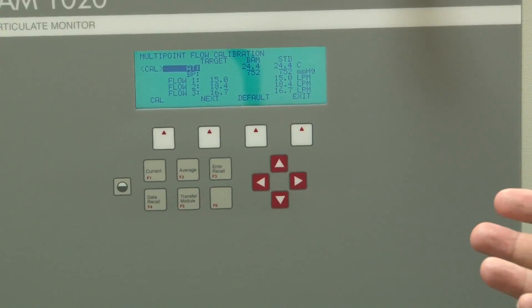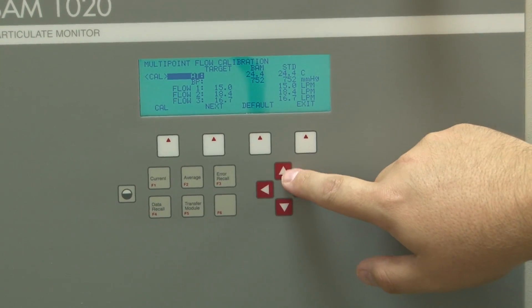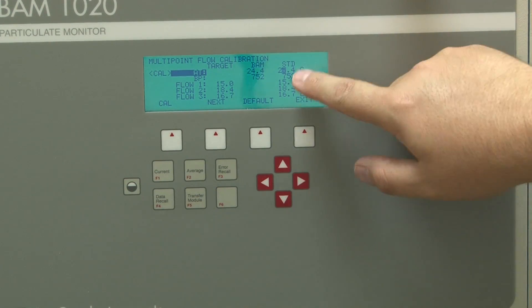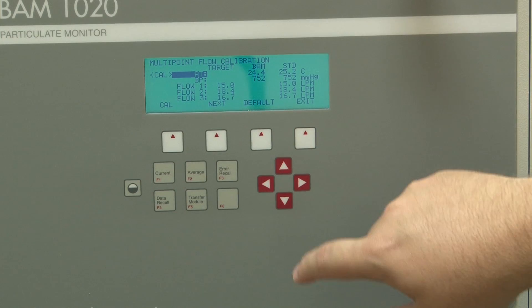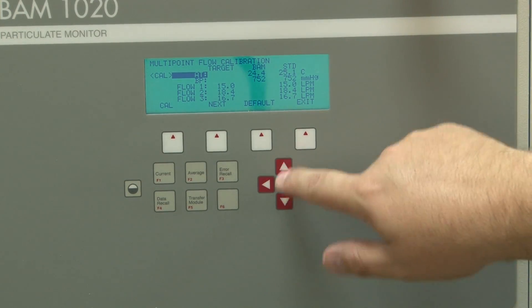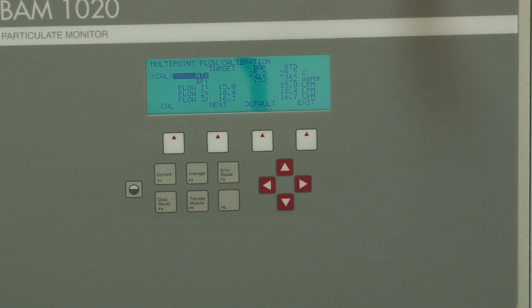For the sake of this demonstration, we're going to say that it was 25.2. You use the red arrow keys to indicate the new temperature — move the arrow over, move it up to 25, then move across and down to 25.2. Then you would hit Calibrate. That's going to set the BAM temperature at 25.2.